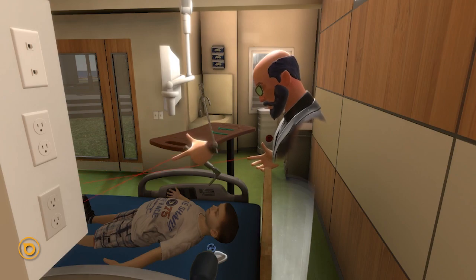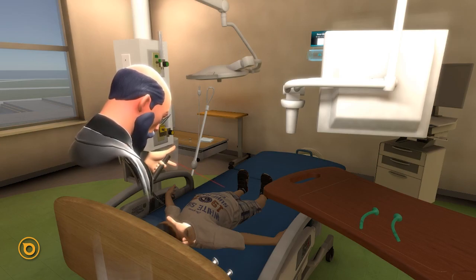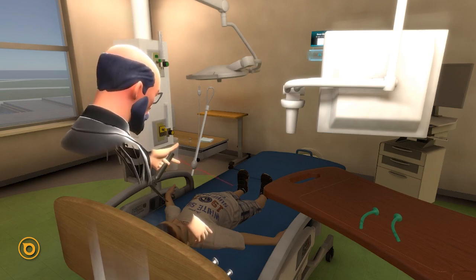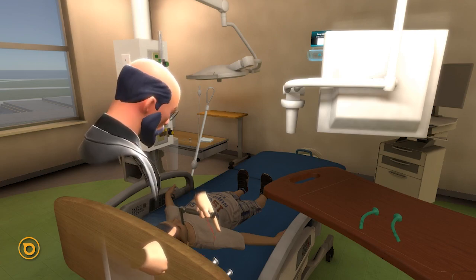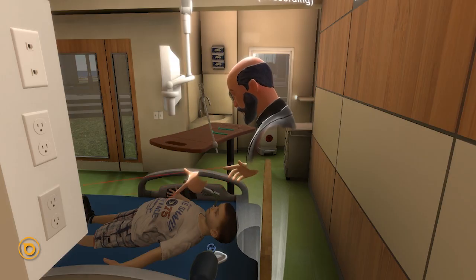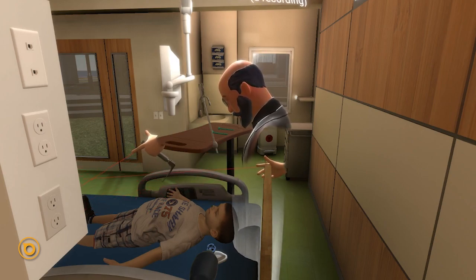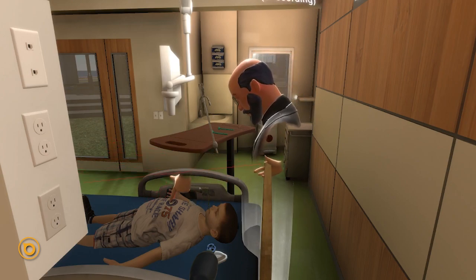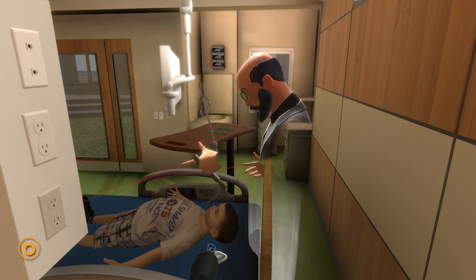Holding the laryngoscope in your left hand, go midline. Use your right hand's index finger to open the child's mouth and your thumb to lever it as wide open as possible. Some people turn the blade sideways, insert it into the right corner of the mouth, and rotate it; others go straight in. The idea is to get the tongue out of the way, then lift the handle upward and away from yourself — not rocking back, as there is a risk of breaking teeth — to get your best exposure to the trachea.